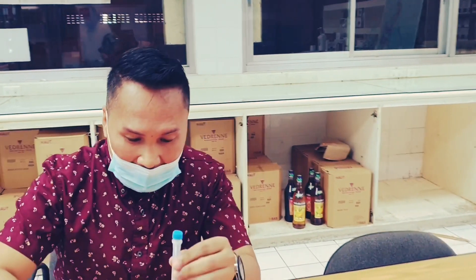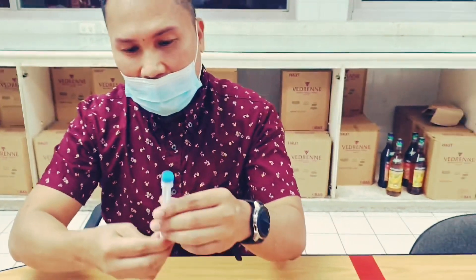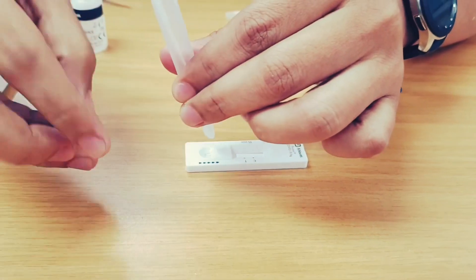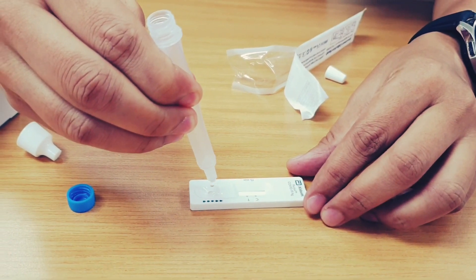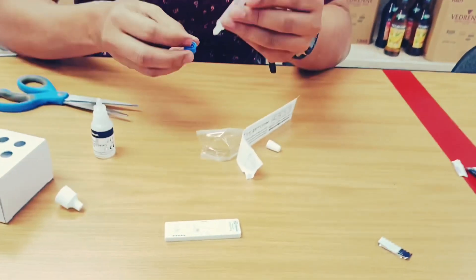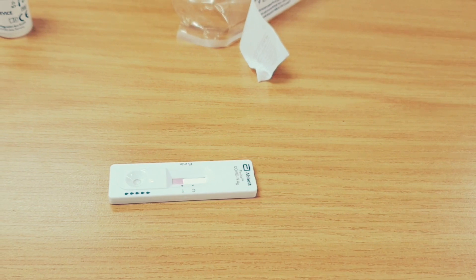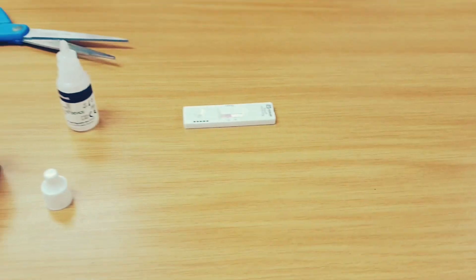Put around 5 drops of the liquid onto the COVID-19 device cartridge in the designated portion — 5 drops is enough. A pink color will slowly slide across, occupying the portion with the letters C and T. Just wait until the entire portion is covered with the pink color.